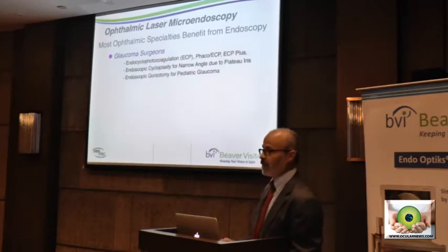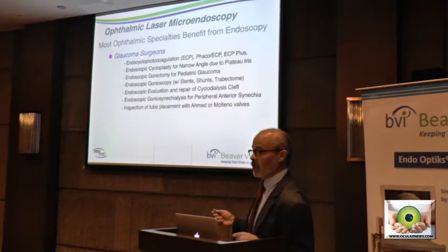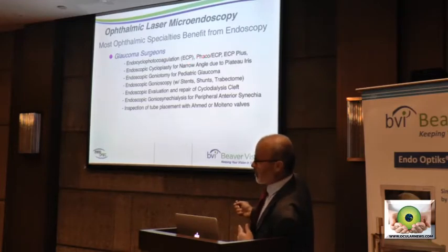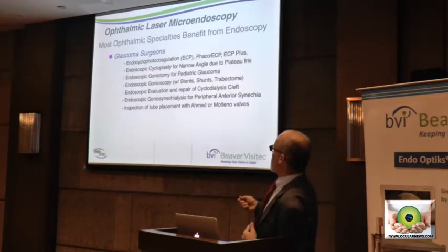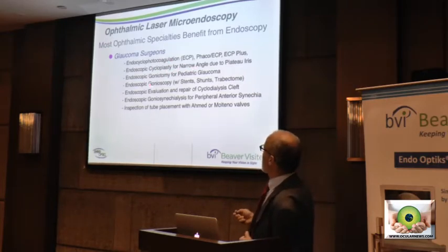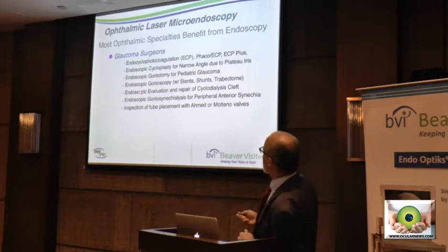So, as I mentioned, virtually every ophthalmic subspecialty can utilize the endoscope for certain applications. In glaucoma, they're quite broad. The most talked about, perhaps the most commonly practiced, is ECP, usually combined with phaco. I'll talk about ECP plus a little bit later. And I'm also going to introduce you to some other techniques, including endoscopic cycloplasty for those intractable narrow angle cases that you'd mentioned earlier, endoscopic goniotomy, which is quite in vogue among pediatric glaucoma specialists. I'll show you how that works.